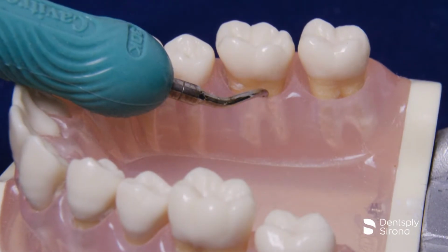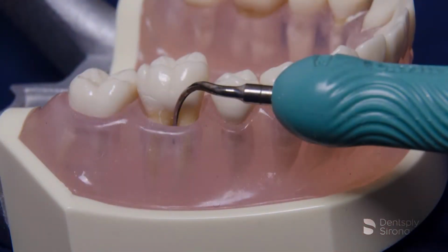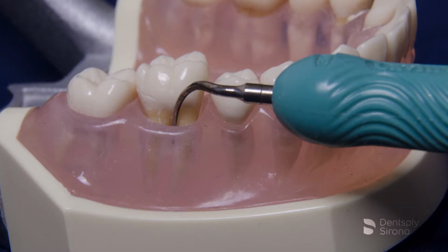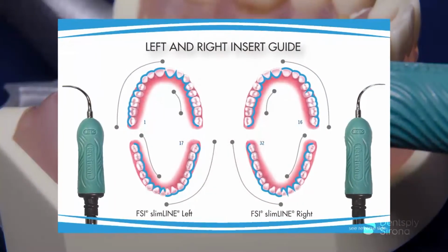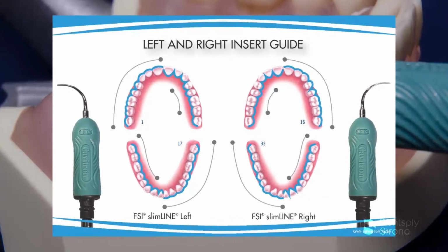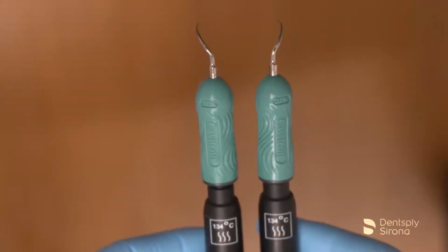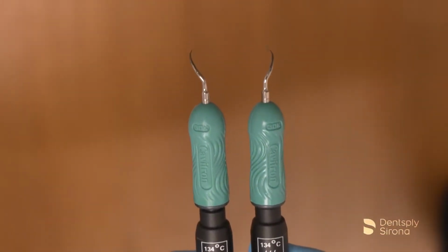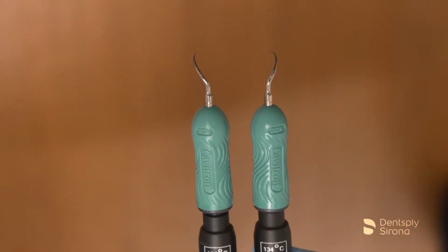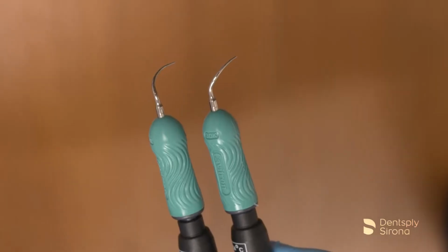A review of dental anatomy is recommended so the clinician is familiar with the topography of the different molars and the corresponding concavities and convexities. Understanding the area-specific design of these inserts is essential for proper adaptation. The clinician must be able to identify the inserts by recognition of the shank and direction of the curvature of the tip. Memorizing colors or trying to read the stacks can be challenging and prove confusing for the clinician.